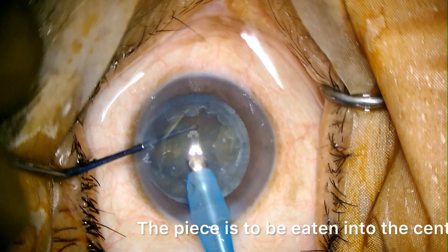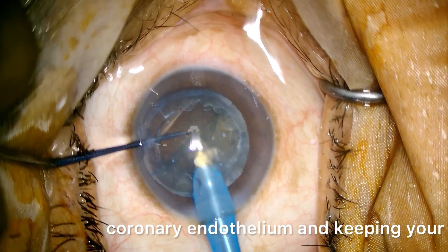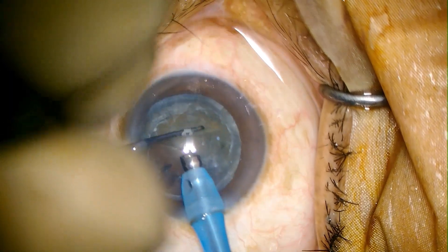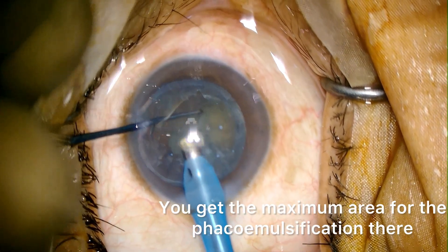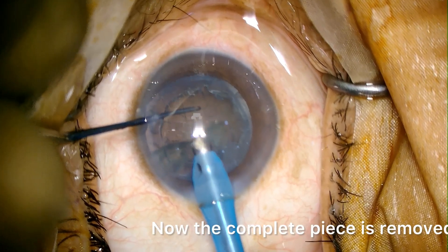The pieces are to be eaten into the center of the eye to avoid injury to corneal endothelium and keeping your probe away from the posterior capsule. The center part of the eye is the safest place — you get the maximum area for phaco emulsification there. Now the complete piece is removed.